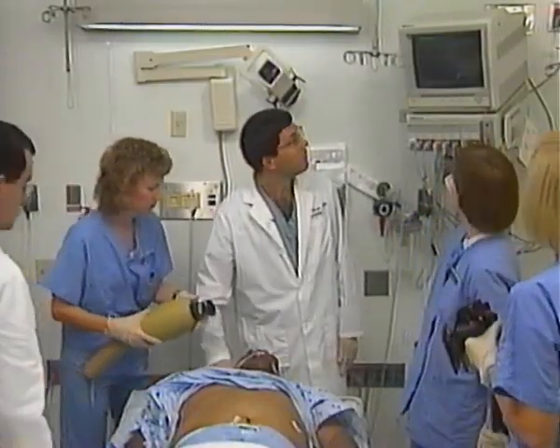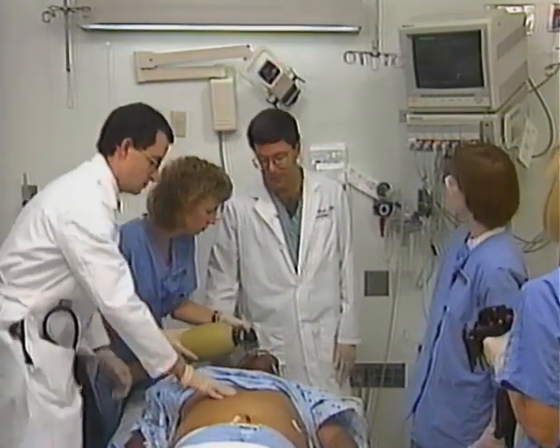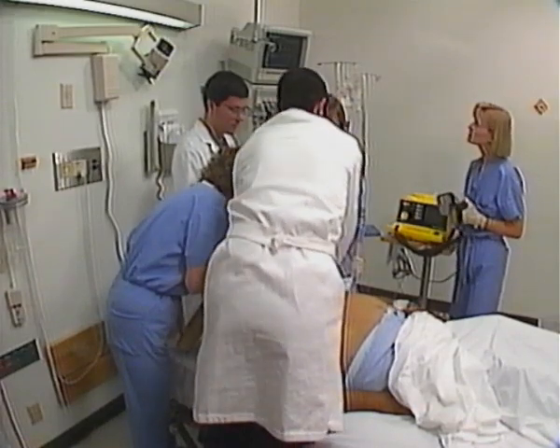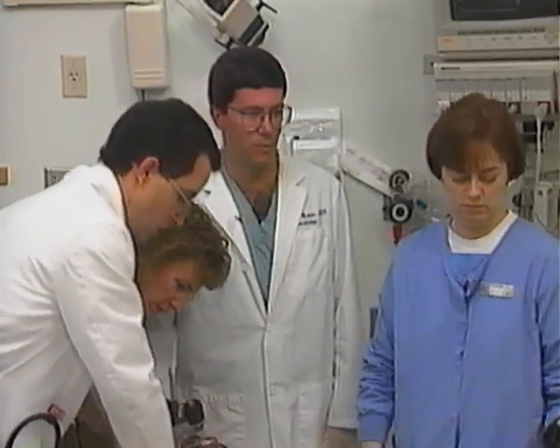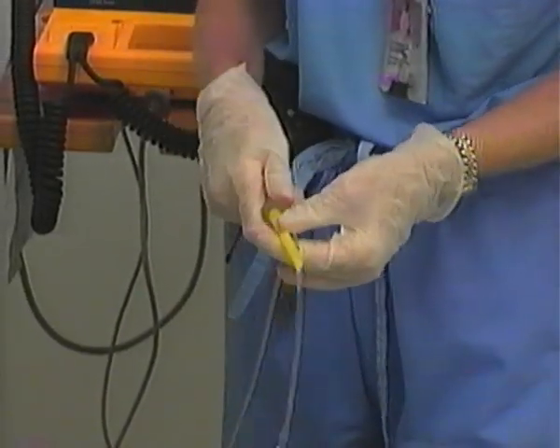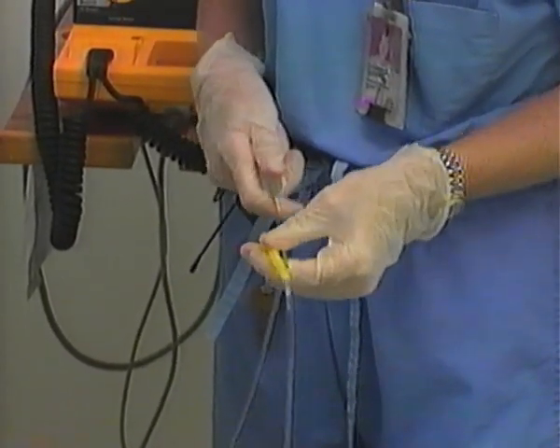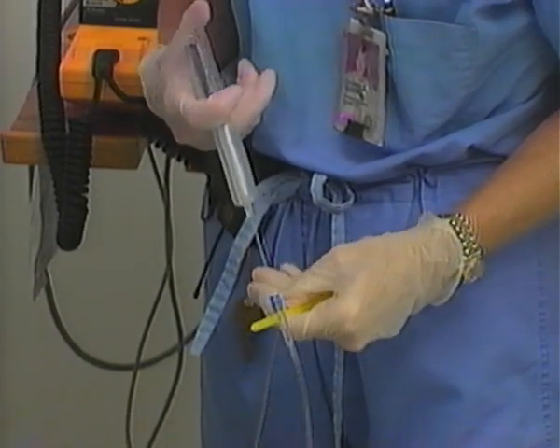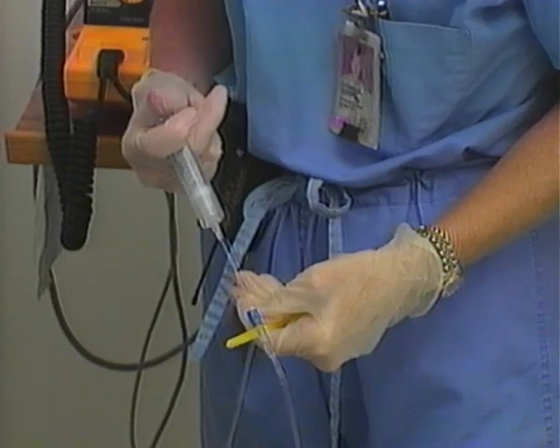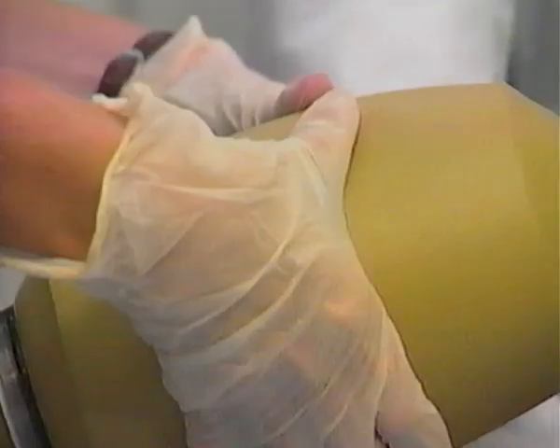I don't have a pulse. He's still in VFib. Let's go ahead and start CPR. It's been 3 minutes. Go ahead and give him 1 more milligram of epinephrine. Epi's in.